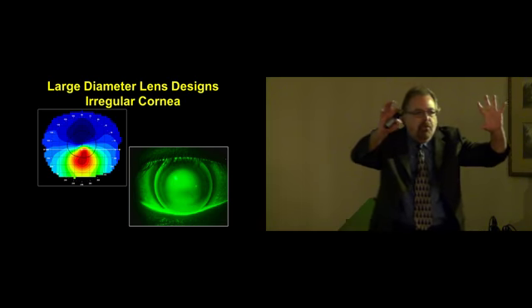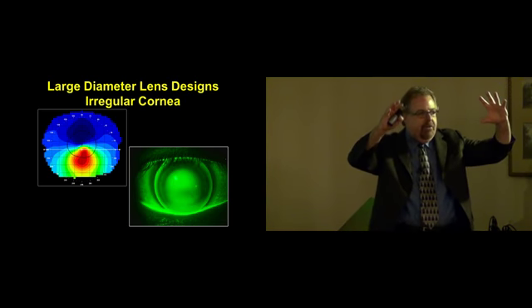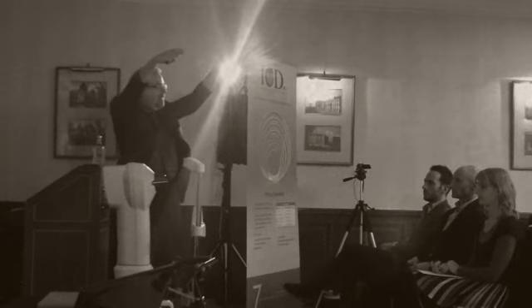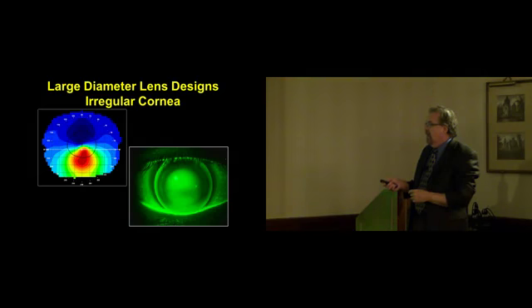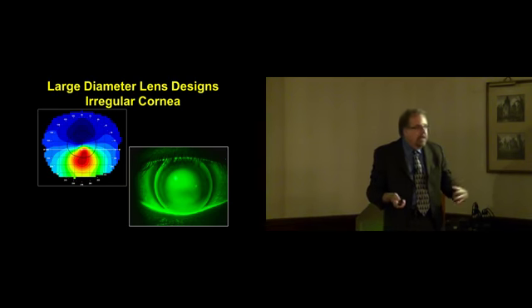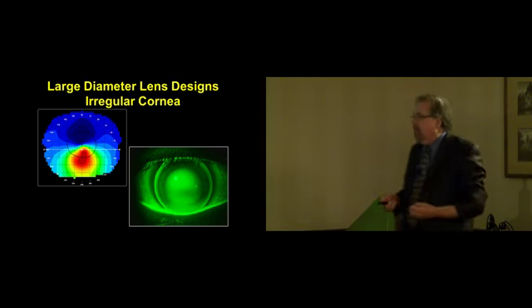We've got a platform on which, when we vault the apex of the cornea, the lens has that luxury of coming down and coming to rest on this area where there is a significant amount of symmetry. So the word symmetry is really the key.